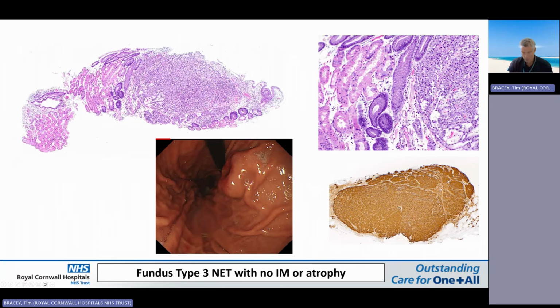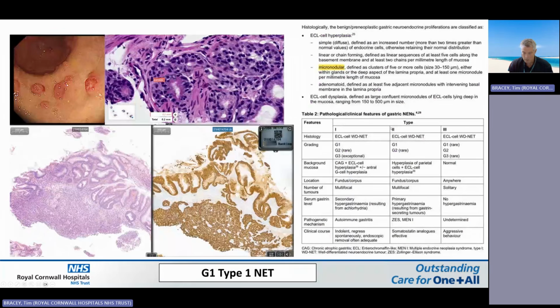Oh, sorry. Type 2s, these are the ones that the medical students get excited by, which are driven by an exogenous source of gastrin, like a pancreatic or a duodenal gastrinoma. I've probably seen one in my life, and that was in a teaching setup.